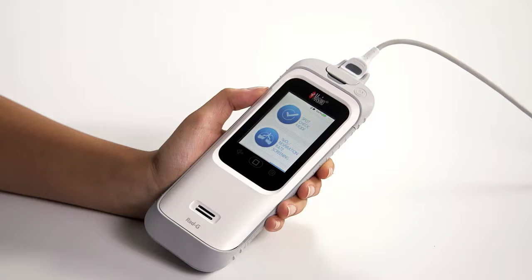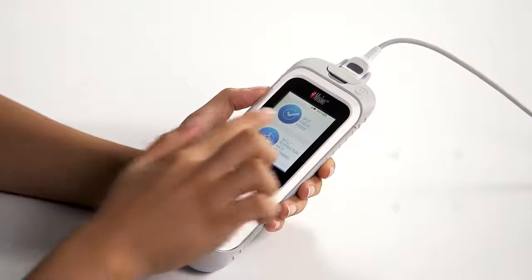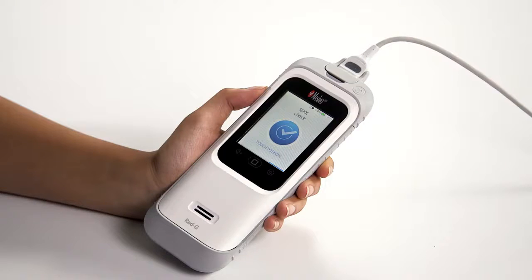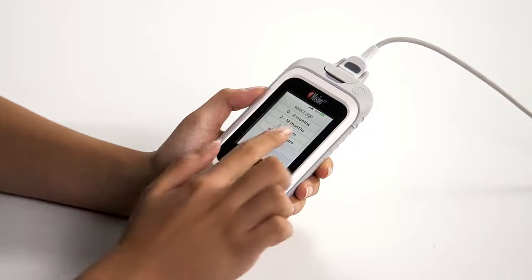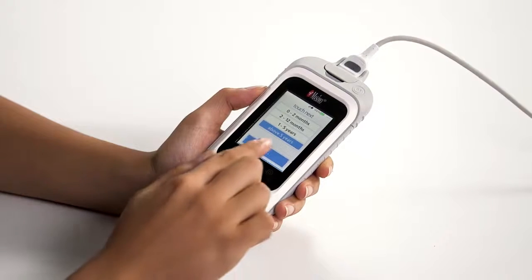RadG also allows for spot checking SpO2, pulse rate, perfusion index, and respiratory rate. To begin, select spot check mode. Touch the spot check screen to proceed. Next, select the age of the patient from the list provided. Proceed to place the sensor on the patient as described previously.